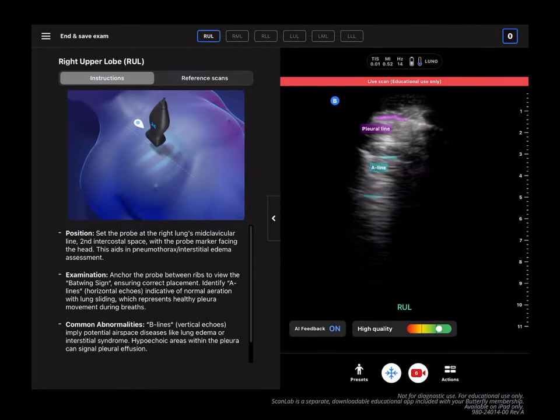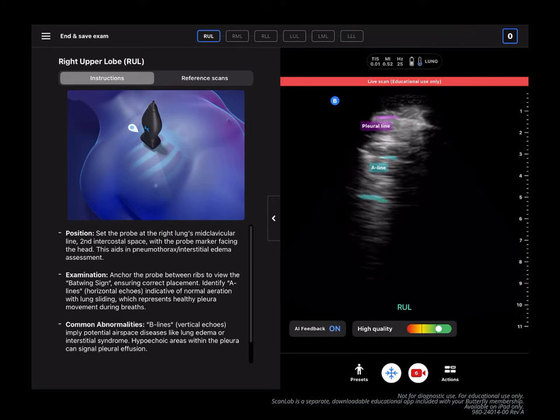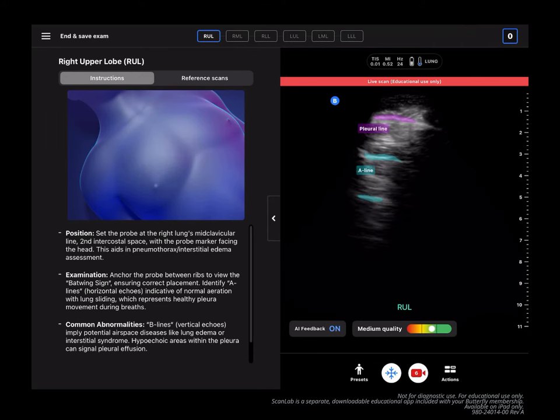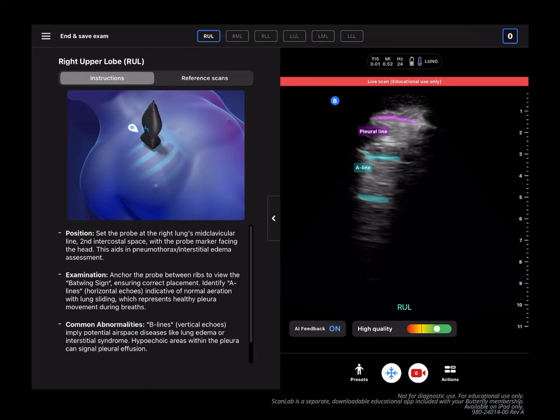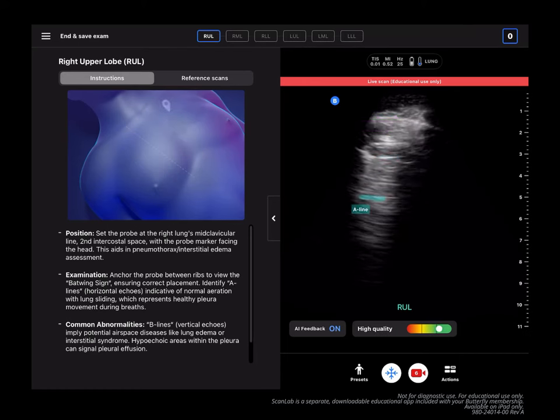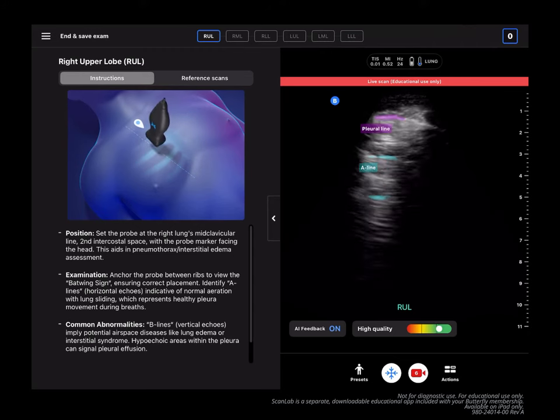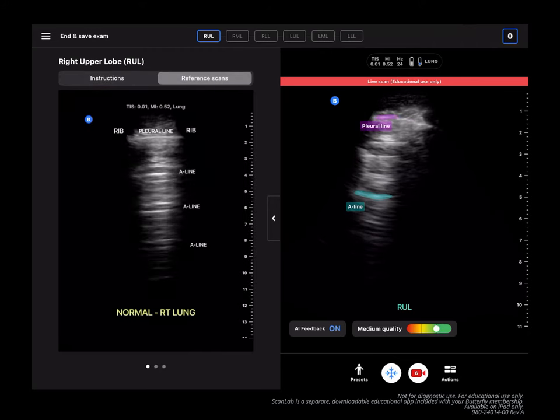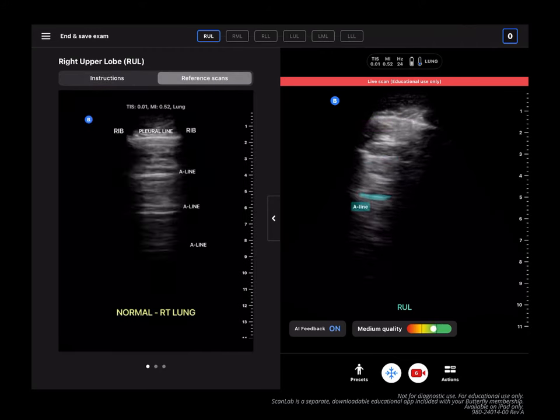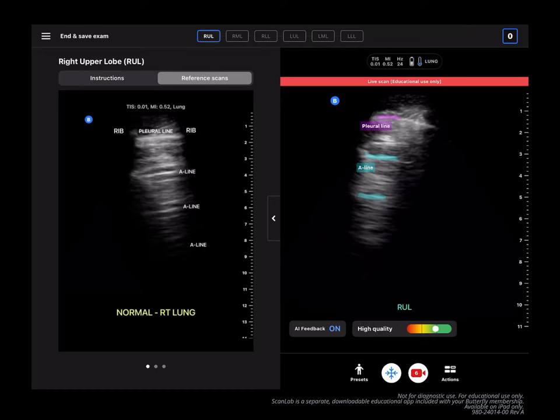As you'll see on the left side of the screen, the app provides instructions for guidance on accurate probe placement, identifying essential anatomy, and learning common abnormalities for each view of the clinical protocol, plus imaging tips and tricks. Toggle to reference scans to view high-quality examples to compare side-by-side with your live scanning image.